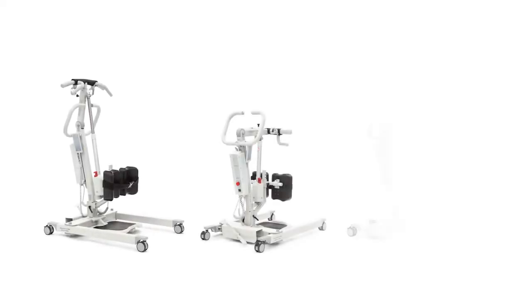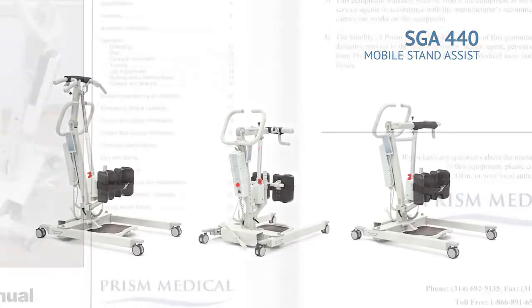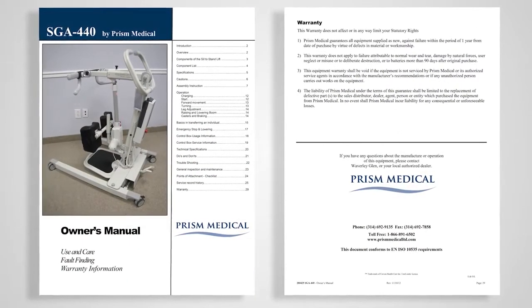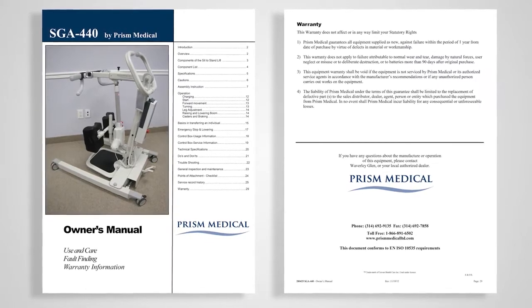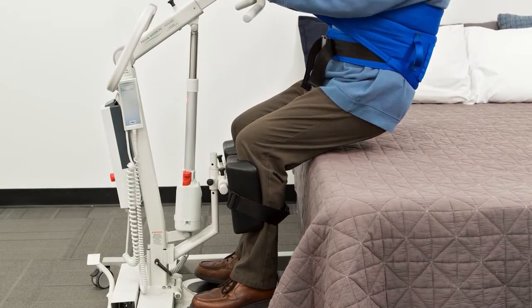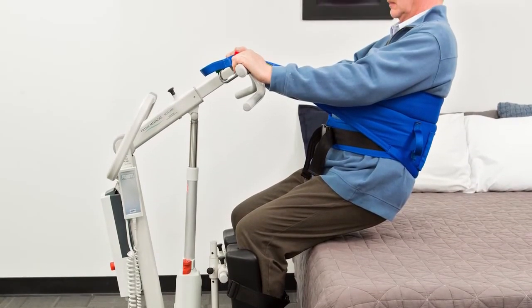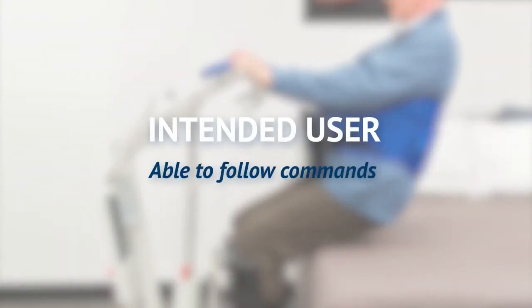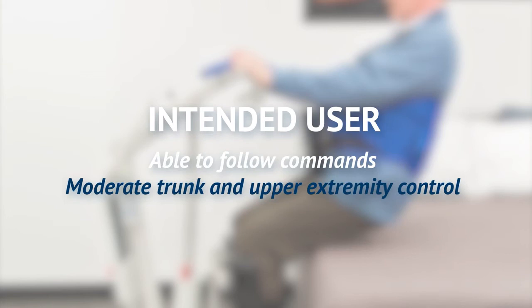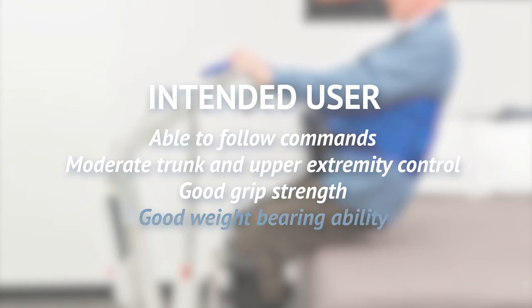This video covers the use of the PRISM SGA 440. Further information can be found in the owner's manual packaged with each lift. The SGA 440 is designed to assist in seated to seated transfers as well as aid in standing during rehabilitation. The patient should have the ability to follow commands, moderate trunk and upper extremity control, including good grip strength, and weight bearing ability.